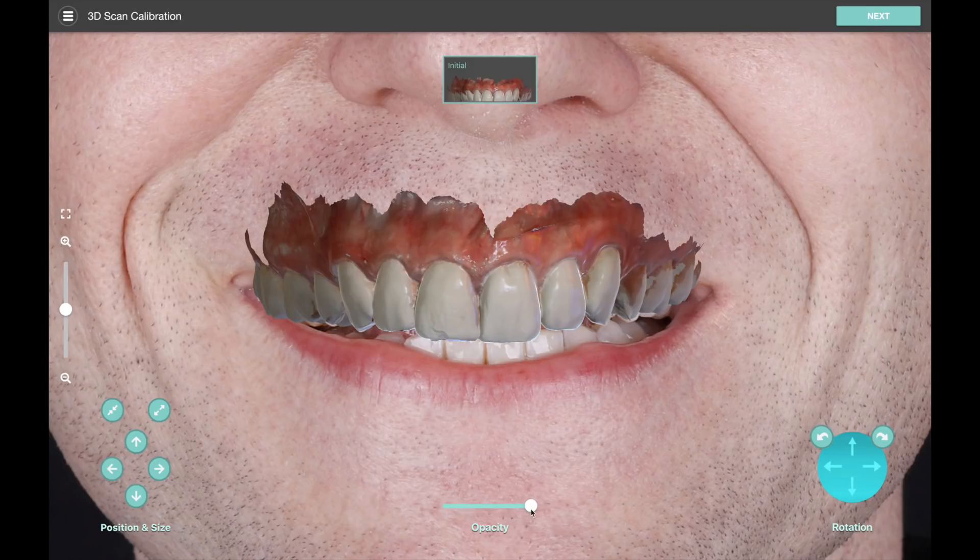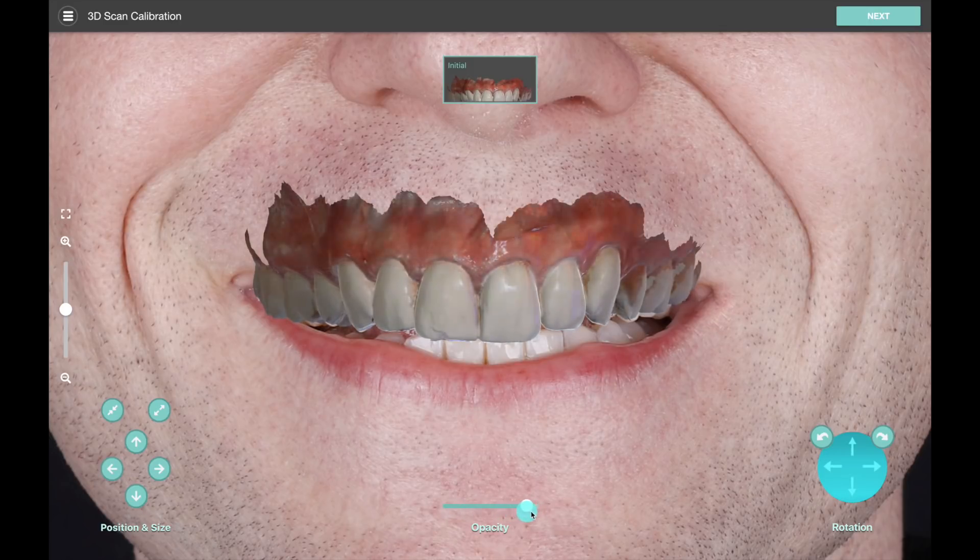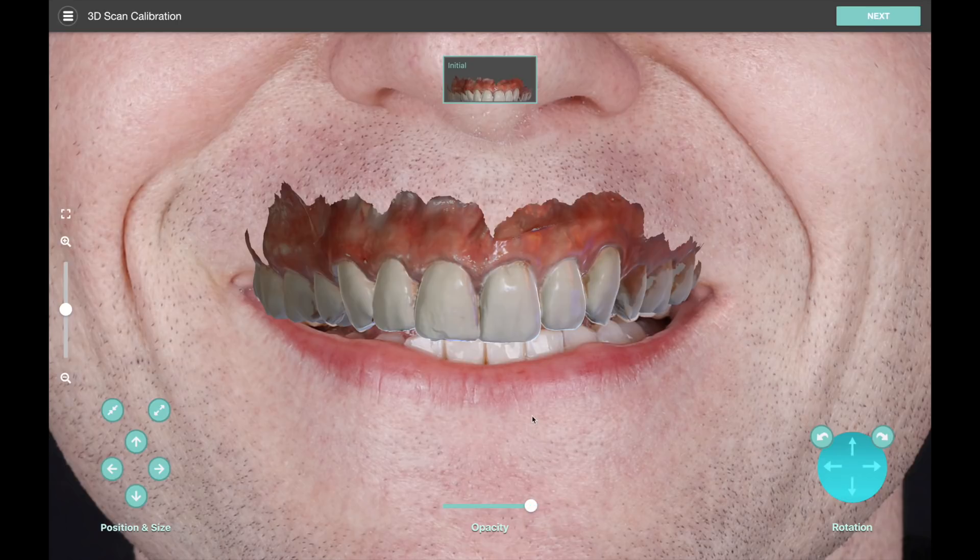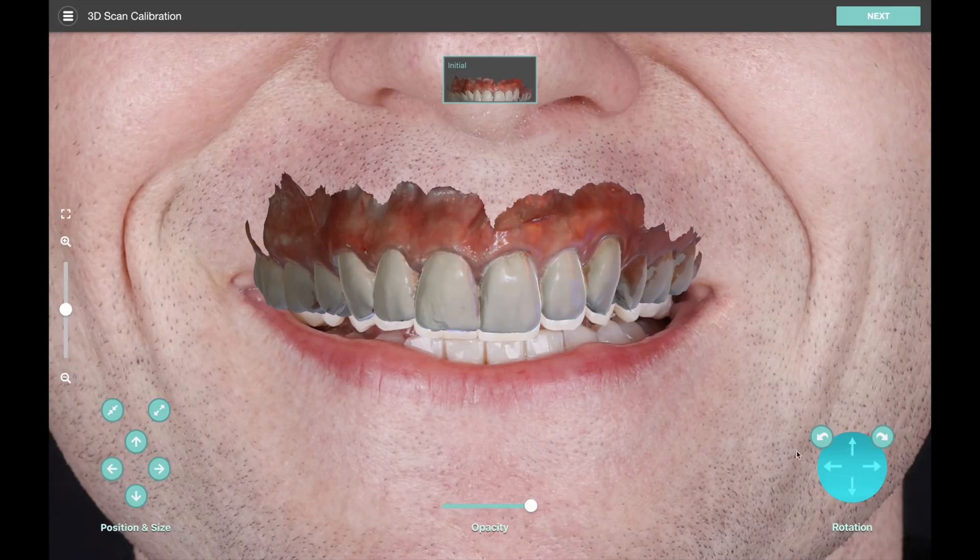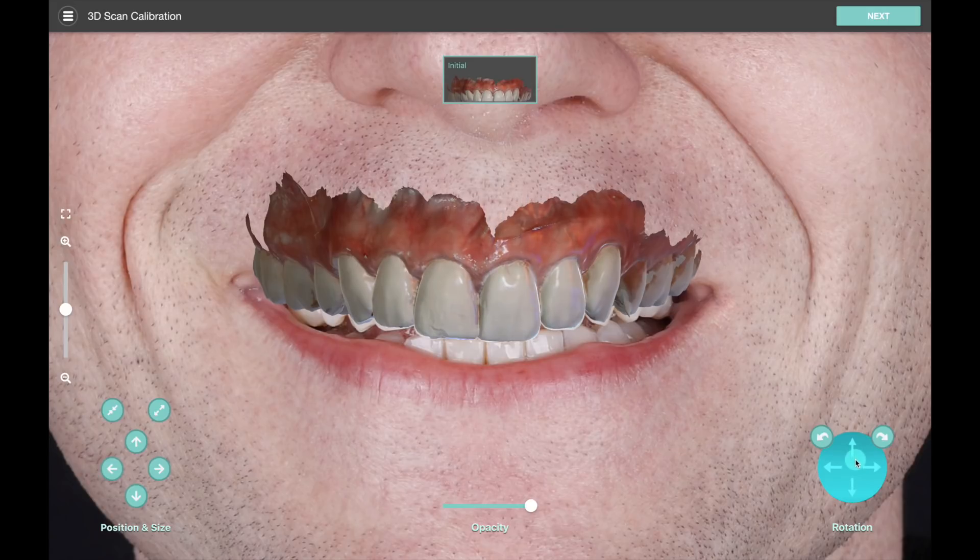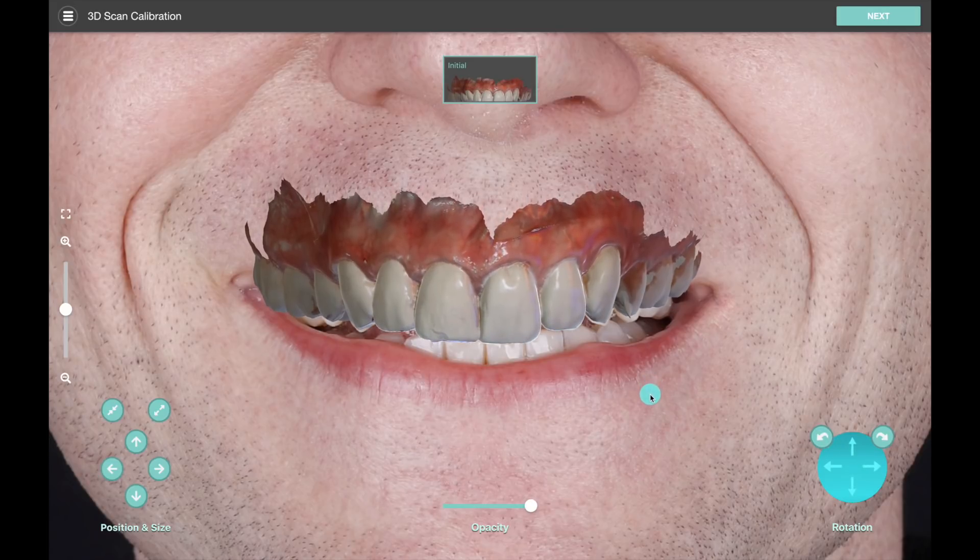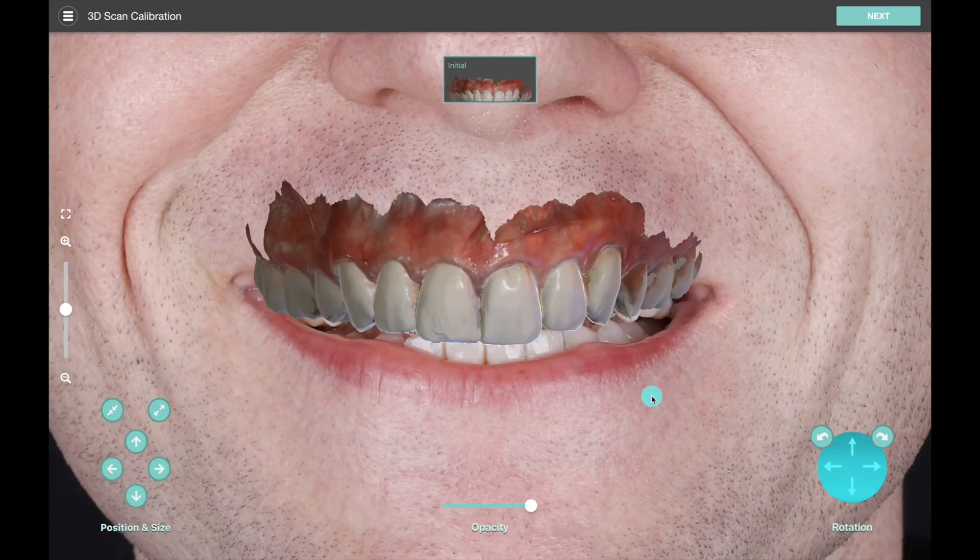And on the bottom middle we can fade the model in and out. We can basically make these little adjustments and get our model to fit the teeth in the photo.